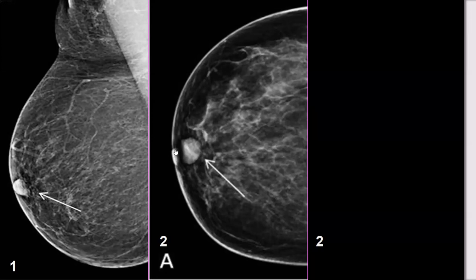And what about this? What could it be? What does it represent? It represents part of the nipple. Yes, you mean this is part of the nipple and this is part? And what about this area? This is fat. There is fat within the nipple? No. The nipple is devoid of fat.